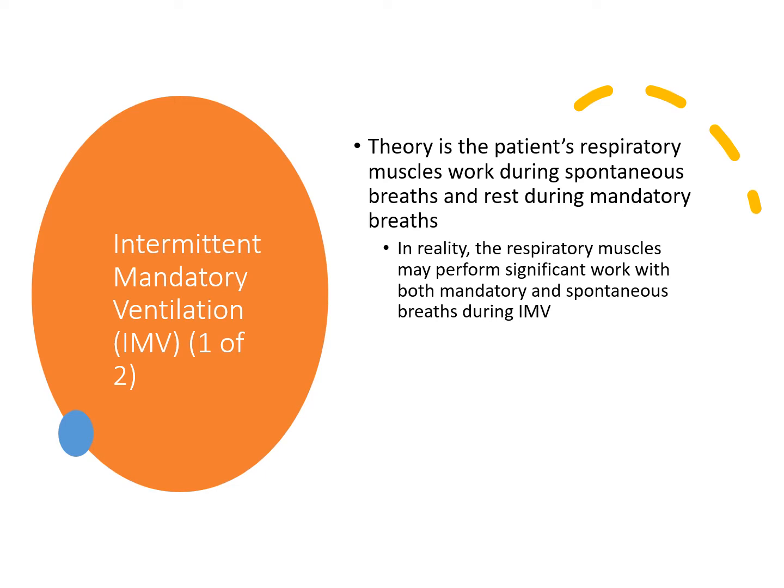But the gas bag would go through the humidifier, right? So it'd still be humidified gas. But during a positive pressure breath, the high pressure would close the one-way valve and then prevent the air from entering the bag and allow the mandatory ventilator breath too. So it was kind of an interesting system. That was the way they set it up for patients that were on a ventilator that controlled it.